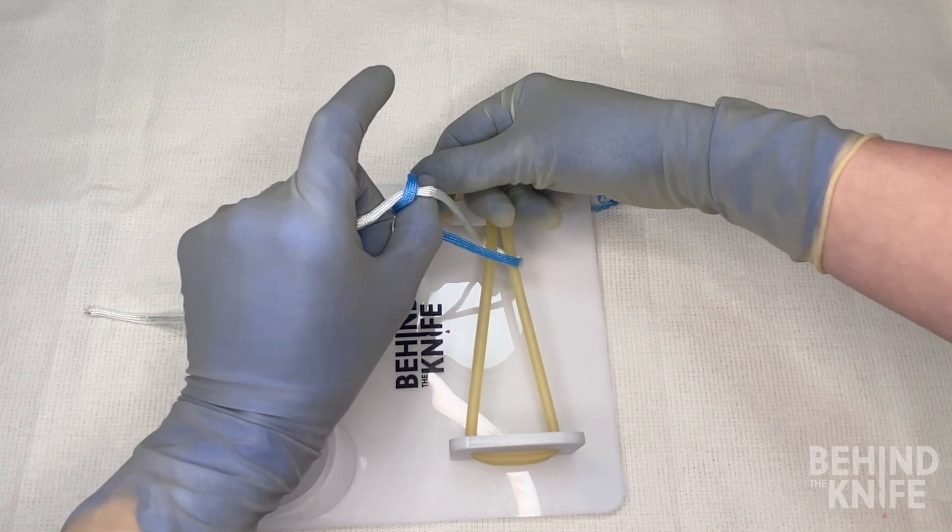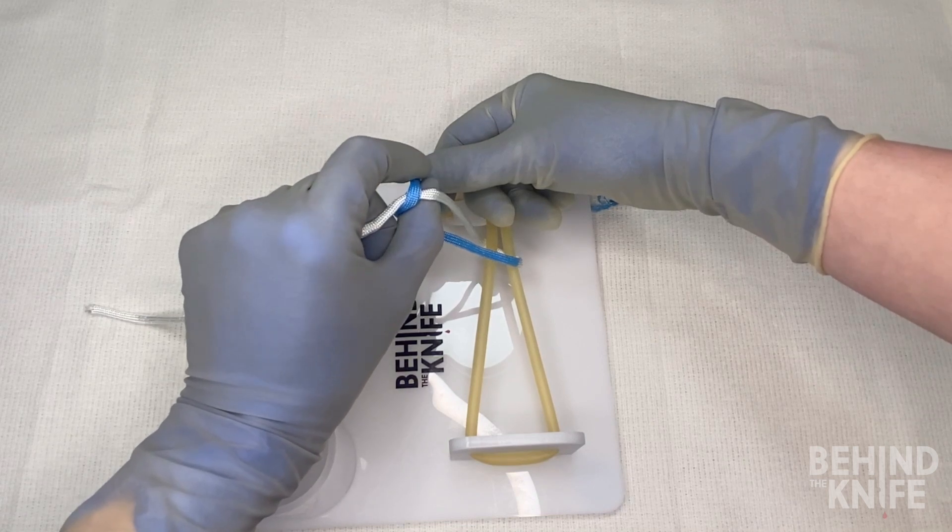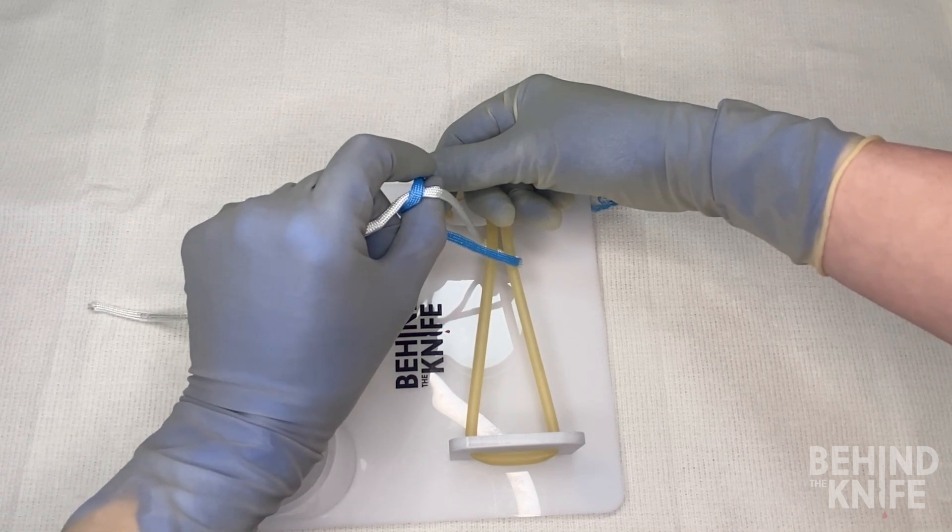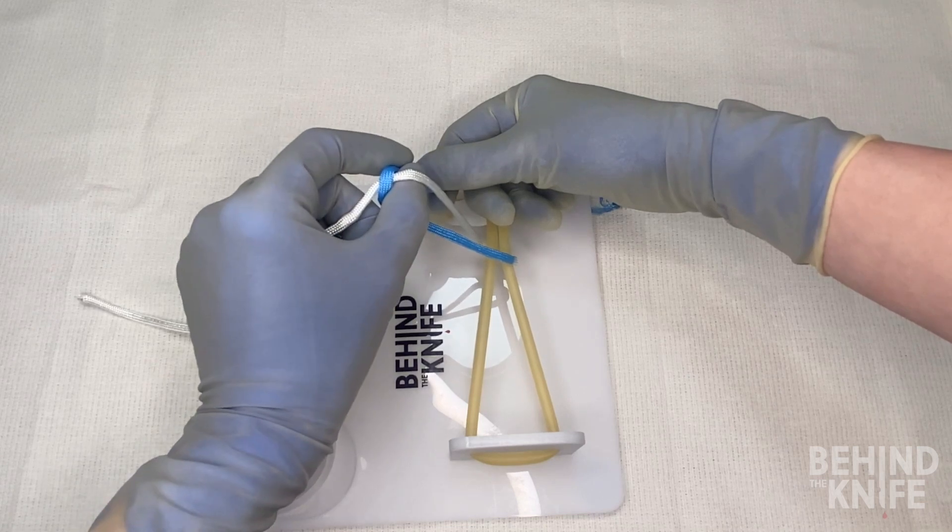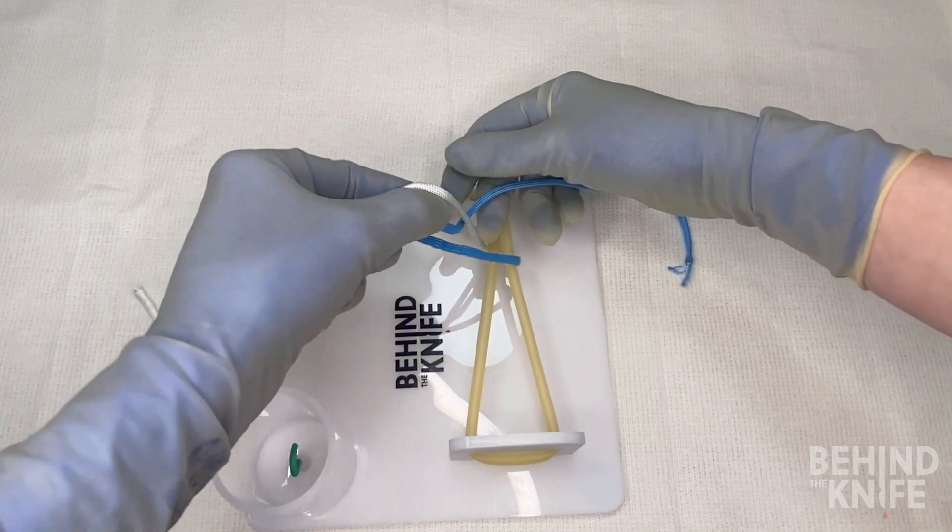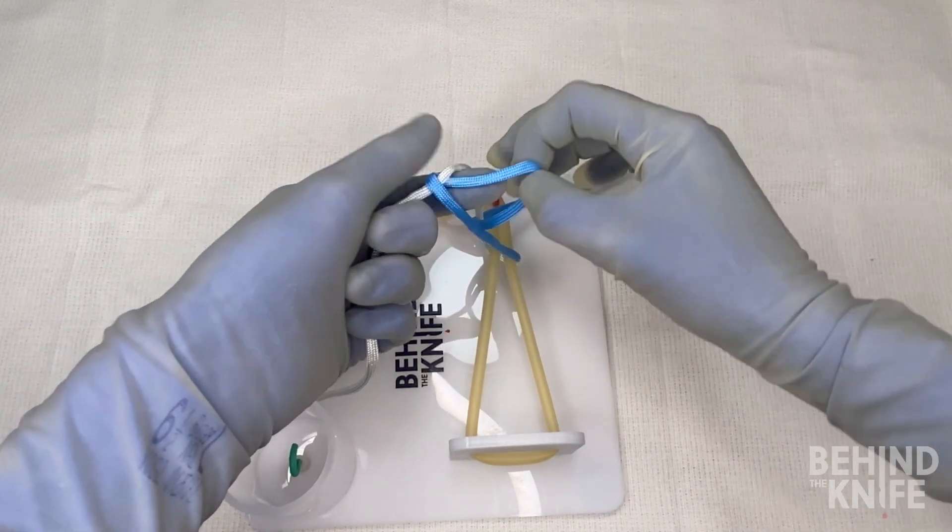From here, we'll once again pinch our index finger and our thumb together, this time with the blue end of our string in between, and we'll rotate our fingers back to where we started, bringing the blue side of the string with us.